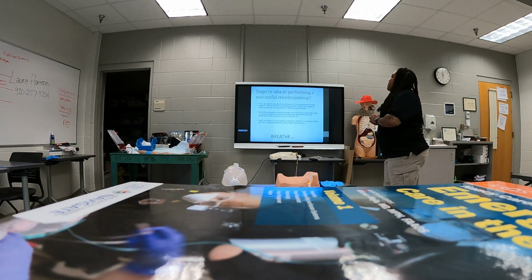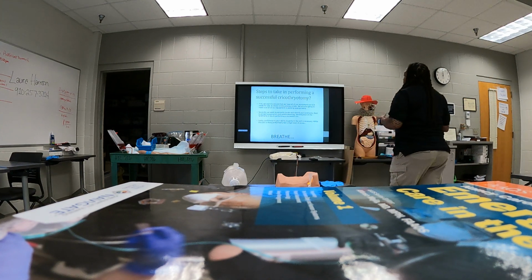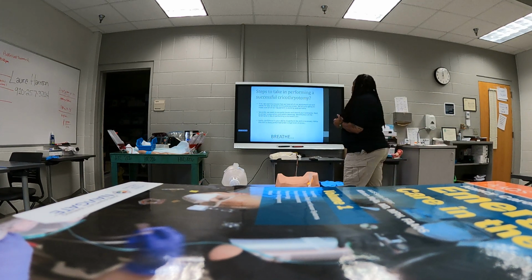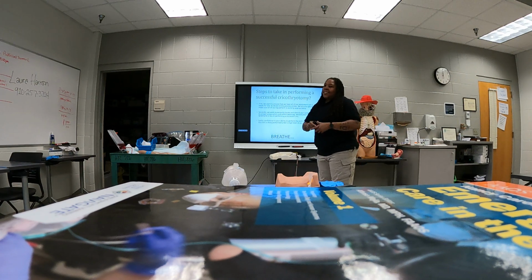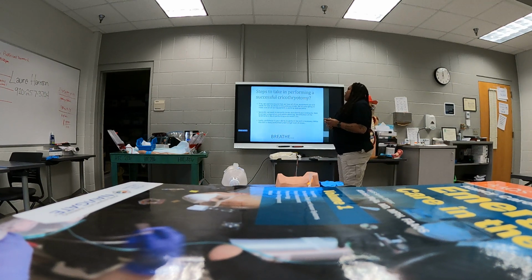So, steps to take in performing a successful cricothyrotomy. First, we want to ensure that we have all of our equipment out and ready for use, as shown in previous slides, as well as I've just shown you. We're also going to make sure all of our equipment is working appropriately. There's nothing like getting in the field on a call and none of your stuff works, especially when you're in a particular situation where you're already in a high stress level. Secondly, we want to correctly locate and identify our landmarks. Next to proper preparation and careful planning, identification of the landmarks is key in performing a successful cric.